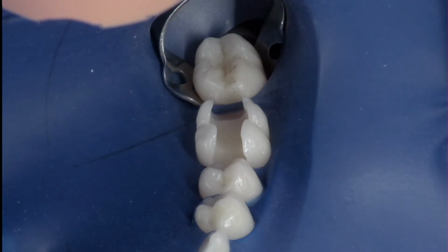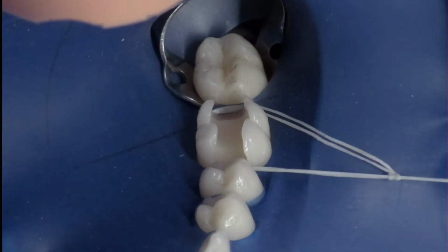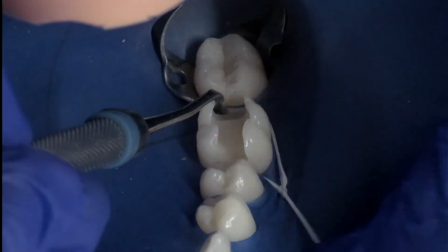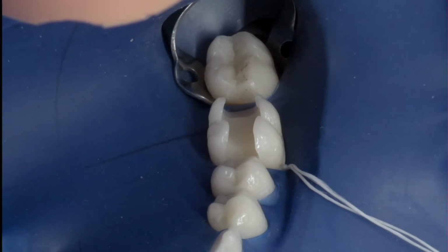I'm going to use the single-handed ligation methodology here to tighten around the tooth because they do have a deep distal and proximal box, or mesial box. And I'm going to try to keep that rubber dam down in the gingiva as low as possible.